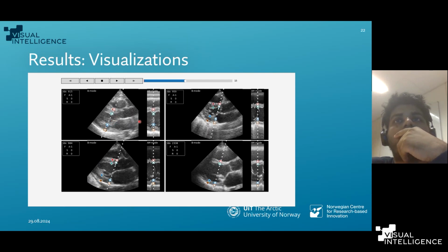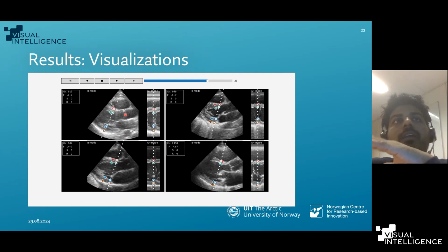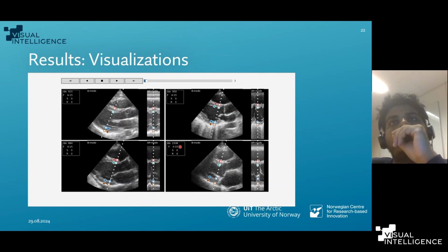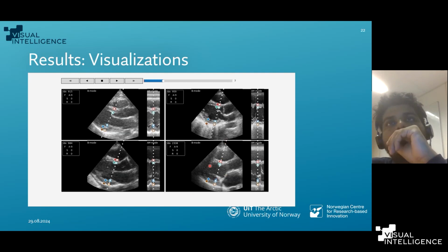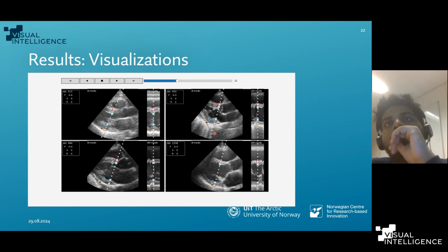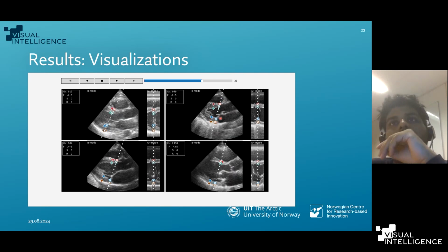Here the AMM model is trained on only one frame, and we try to have a fixed scan line but change the frames, and see how the B mode and the AMM model assign the landmarks. Since the scan line is fixed, the AMM model always tries to place the landmarks on the scan line, so there is less jitter because we are constraining the landmark prediction.